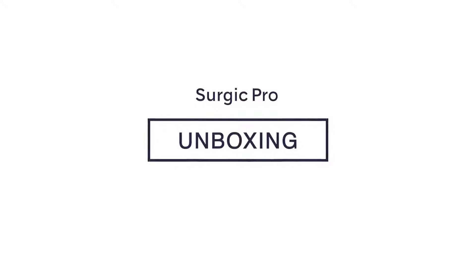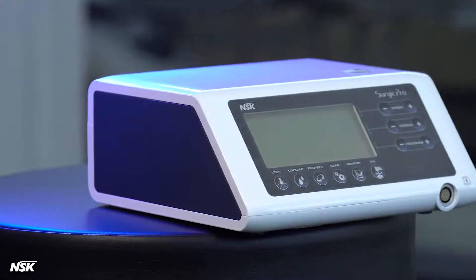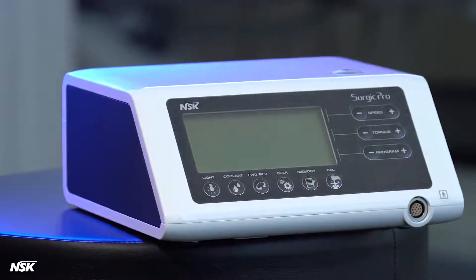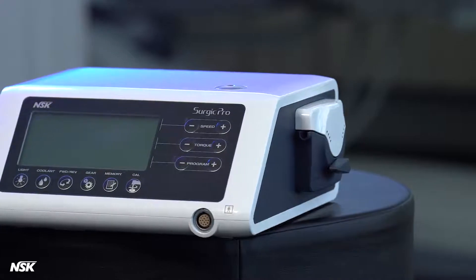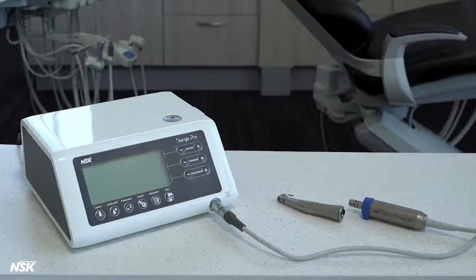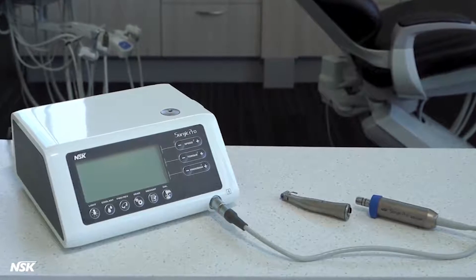NSK Surgic Pro is a surgical micromotor for implant and oral surgeries and comes in two models: optic with LED light, and non-optic that does not have light. In this video, we'll explain the contents of the original packaging.